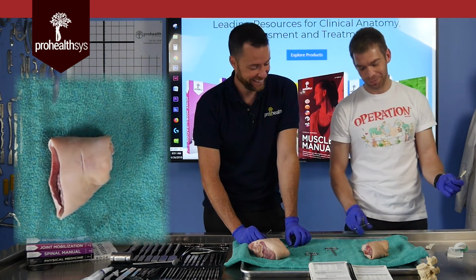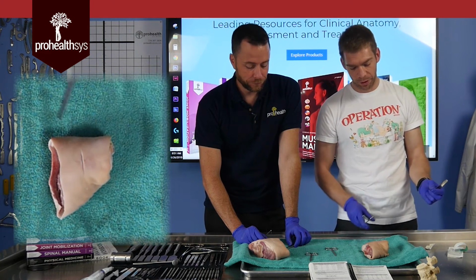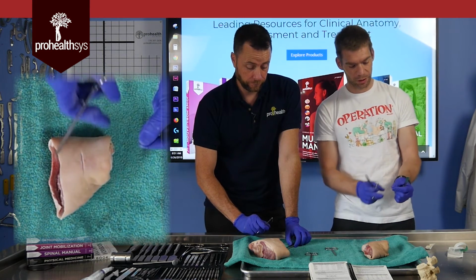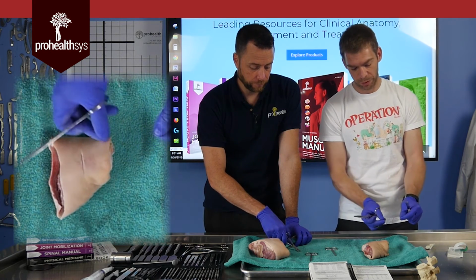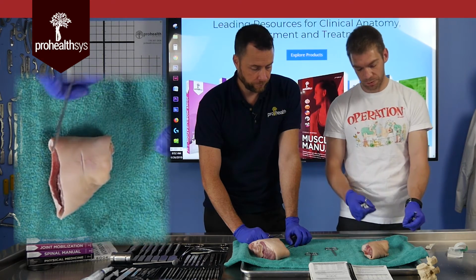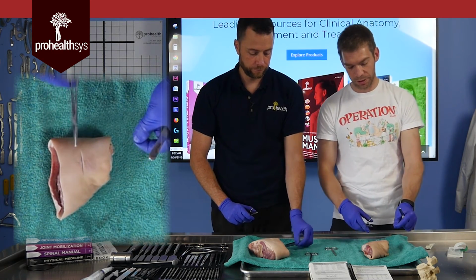Anyway, so in order to tie this knot, we've got a few things we have to do. A, we have to make sure that we're not stabbing any of our neighbors or the patient or anything like that with a needle that's flailing around. So be cognizant of where your needle is. I like to put it down a little bit towards myself. And not only that, I don't do big movements. This is one of the advantages of dealing with lots of suture material. Once this needle comes down, it'll kind of stay there.